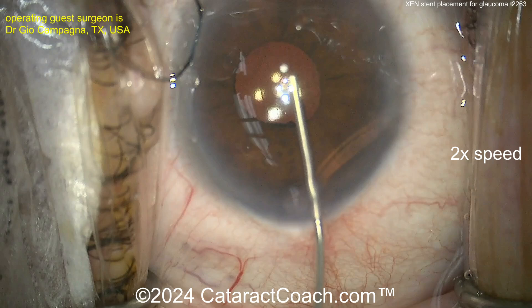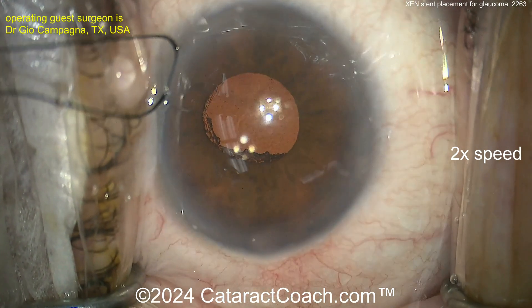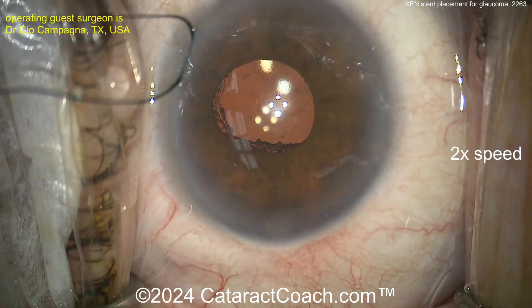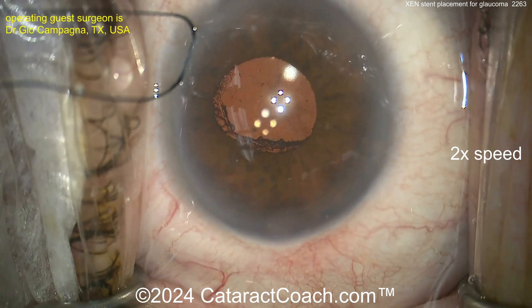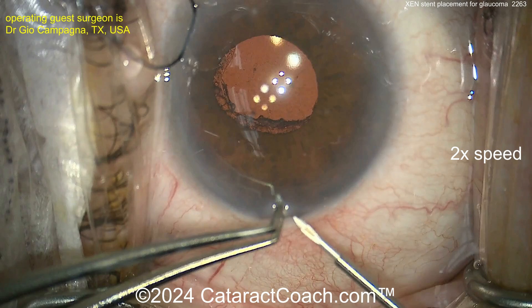Going inside with some viscoelastic just to give yourself a little bit of room — that looks great. The ideal placement of this Zen stent is just anterior to the trabecular meshwork. After it's placed, we're going to put up the gonio to check and confirm its positioning.